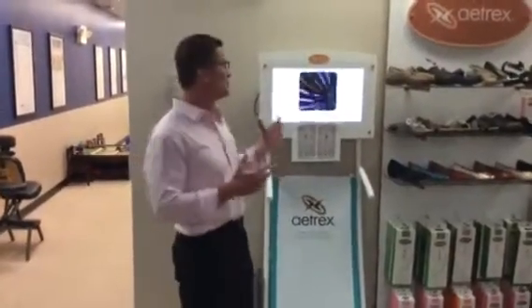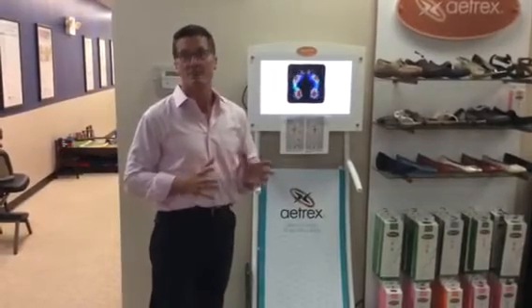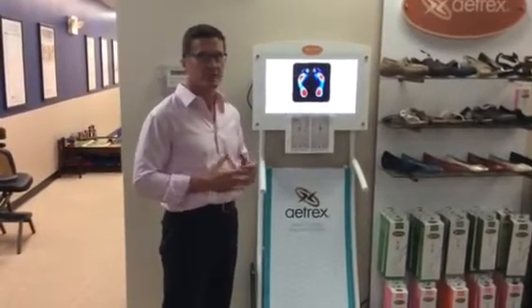Hey everybody, it's Dr. Dain, and I wanted to show you something that we use in our office that we absolutely love. We sell a ton of orthotics and this is a system called Atrex, and I want to show you how simple it is to use.